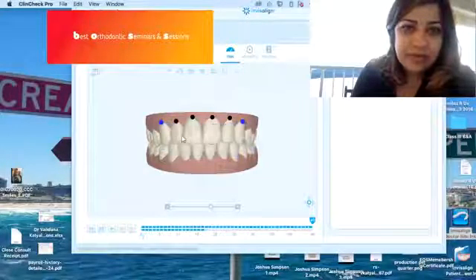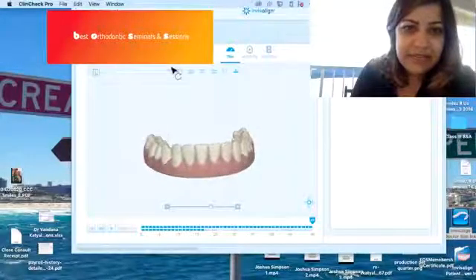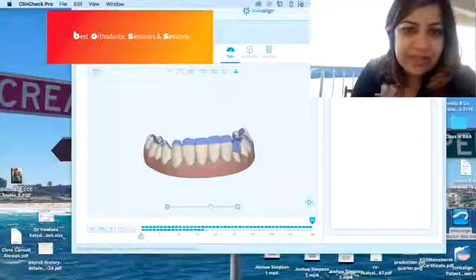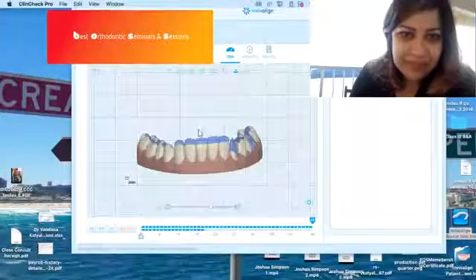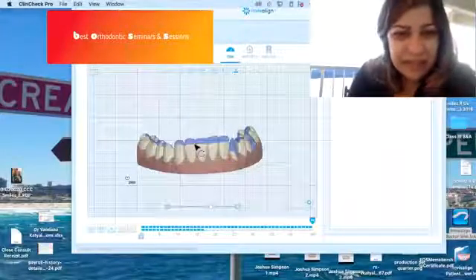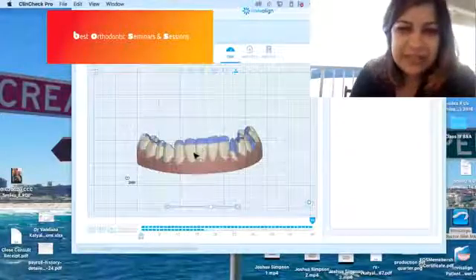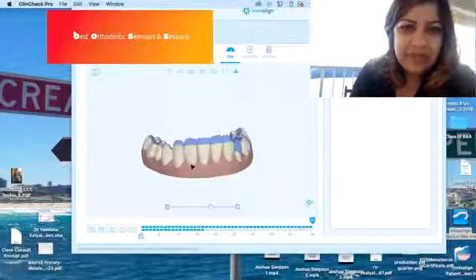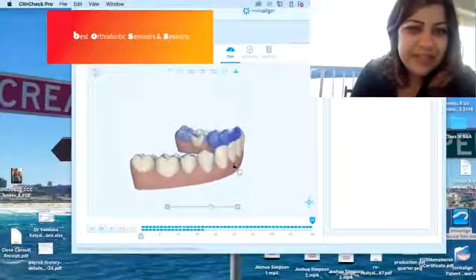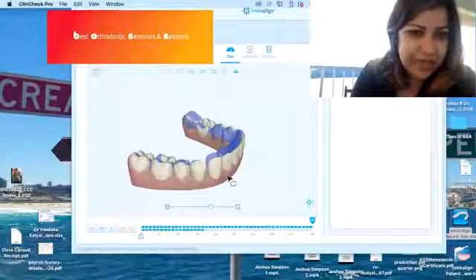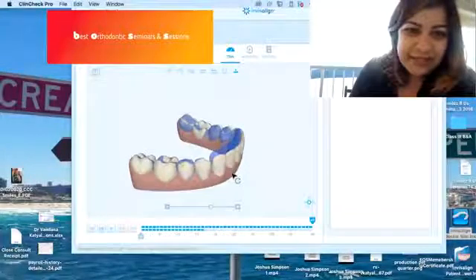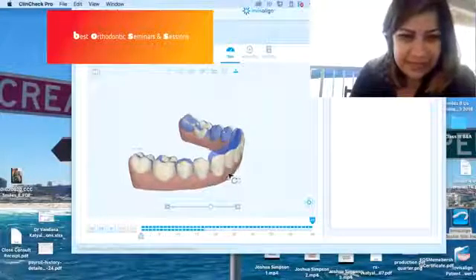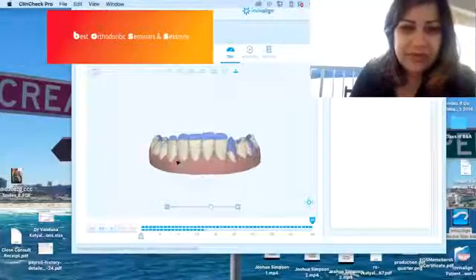So, 5 millimeters of intrusion has been planned. Let's take the grid off, let's take the super off. Let's look at the lower incisors. Did they plan any intrusion here? Yes, they did. How much is that? About 2 to 3 millimeters. That's biologically possible. Maybe half of that, but it can happen. But what they did is had literally no extrusion in the posterior area. Blue is where pre-treatment is. White is end of treatment. Literally no extrusion in posterior area.